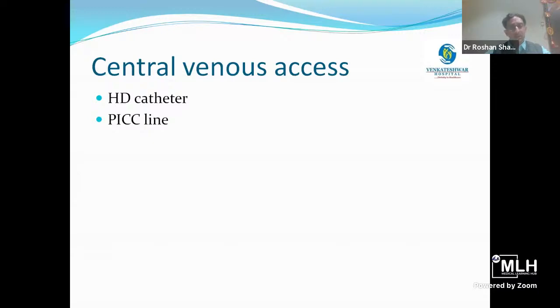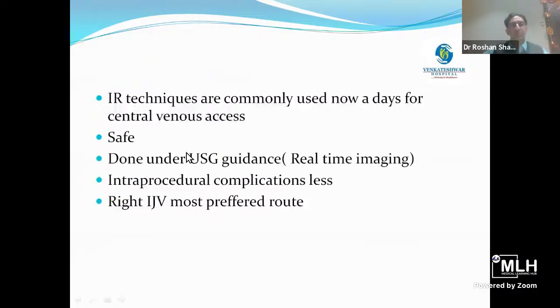In the blind technique, there is a chance of damage to the surrounding structures. So in ultrasound guidance, we are specific. We can see the target, and we can see the movement of the needle. So damage to surrounding structures is very minimal, and intra-procedural complications are less.